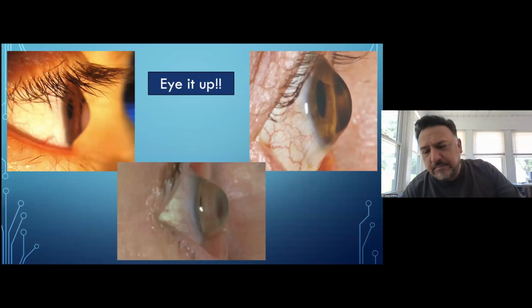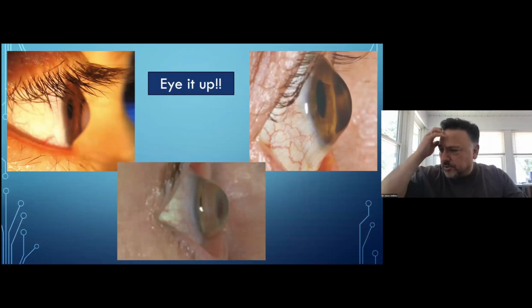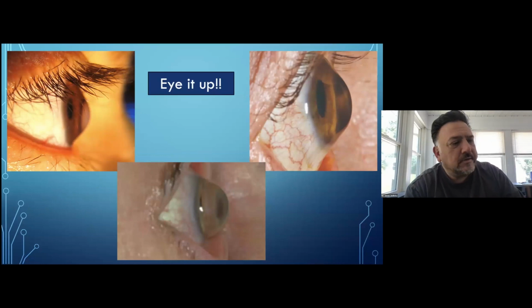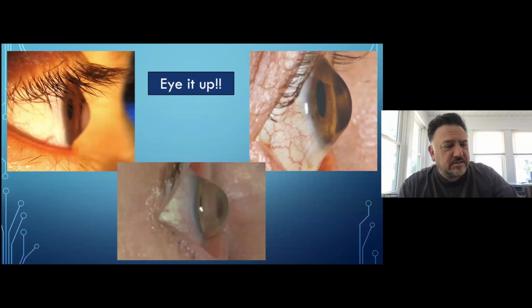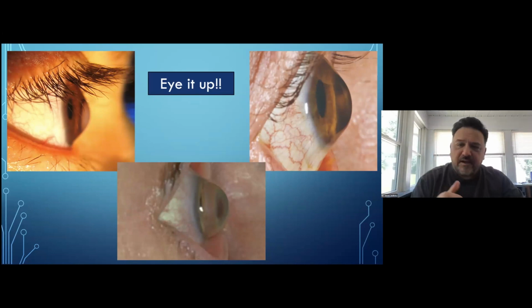I can recall many years ago, early in the process for me of fitting sclerals, which started in 2003 maybe, that I had a consultant from a lab come to my office and bring a fitting set of scleral lenses, and I had set up 4 or 5 patients to fit. A lot of us have gone through this process with a lab before, and we brought in the patients, and the consultant took a look at the patient and got alongside them and had them look straight ahead and pulled their lids apart and looked at their eyeball, just like you kind of see in these pictures.